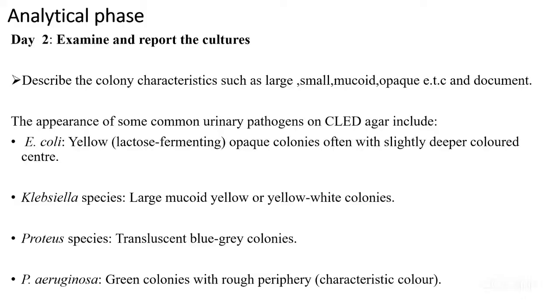Then on day 2, you will come and examine and report the cultures. You will describe the characteristics of your colonies, whether they are large, small, lactose fermenting, non-lactose, or opaque. You describe the physical characteristics of the colonies that you are seeing, and make sure you document.